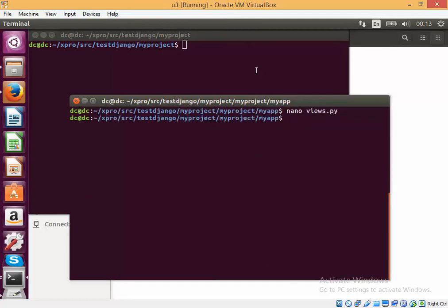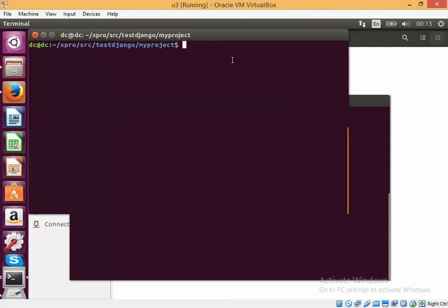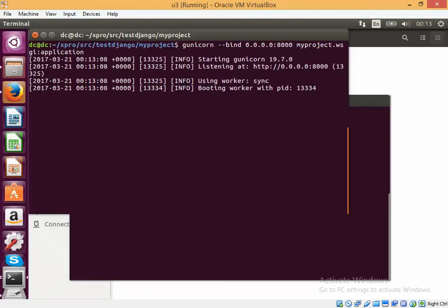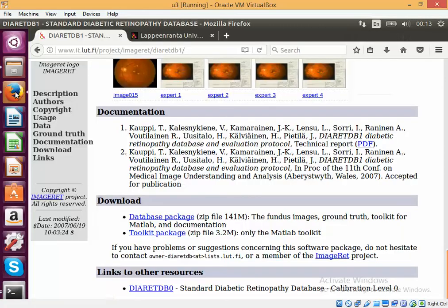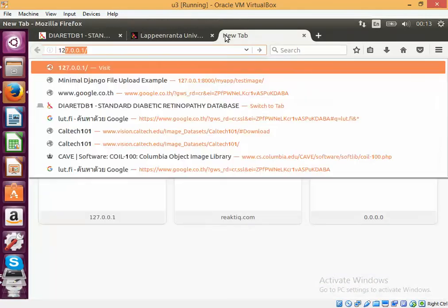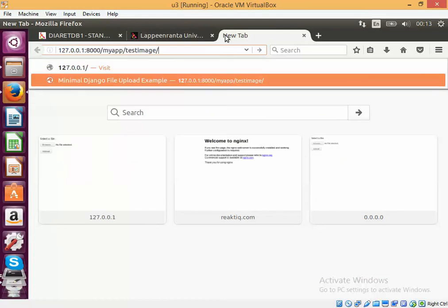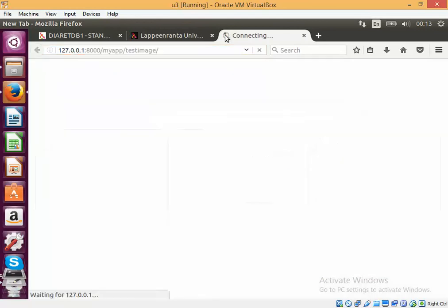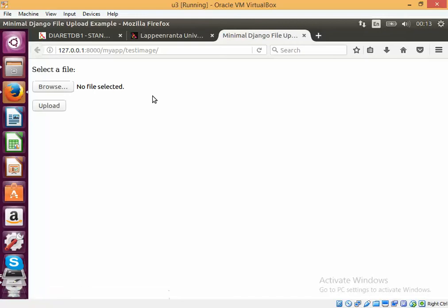So let's start the Gunicorn server. You see it has started already. Let's go. Okay, so we have got the web page. In the web page we can browse.